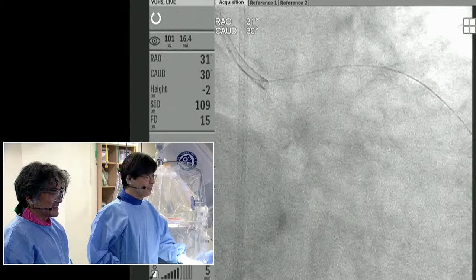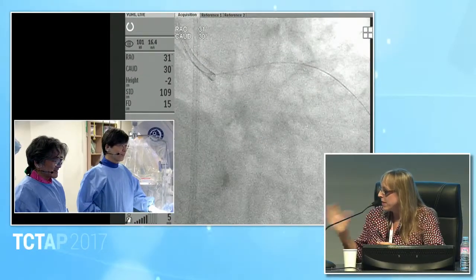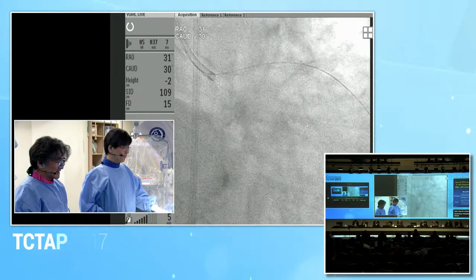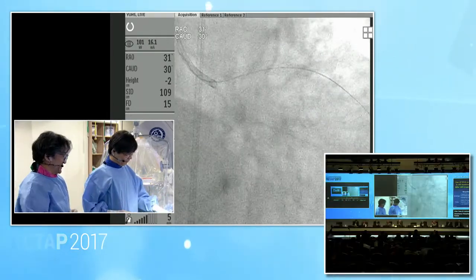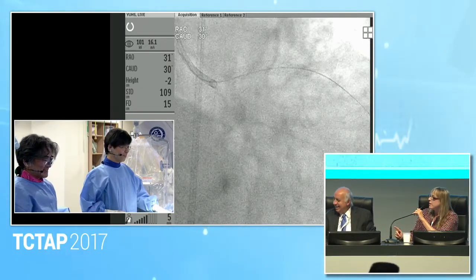What would be any additional information that you get at this point from an angiogram? Please, I challenge you. We can ask the audience. Do you need an injection? Raise your hands. 90% we needed. What information are you getting? We should not ask questions like this one.